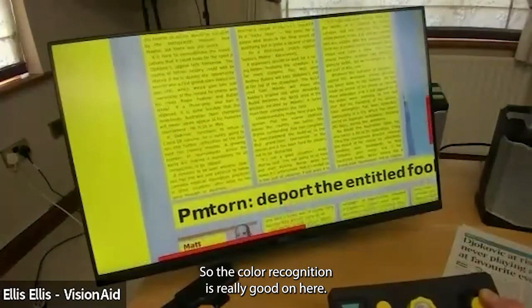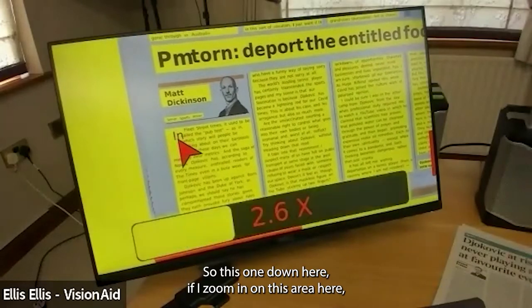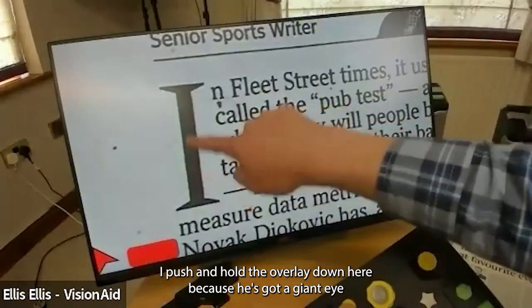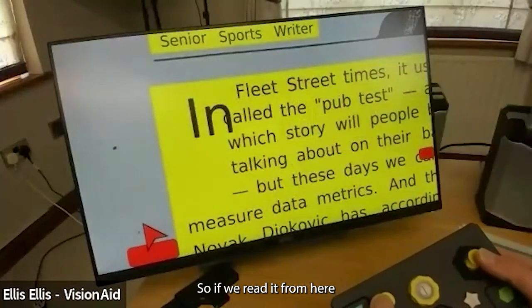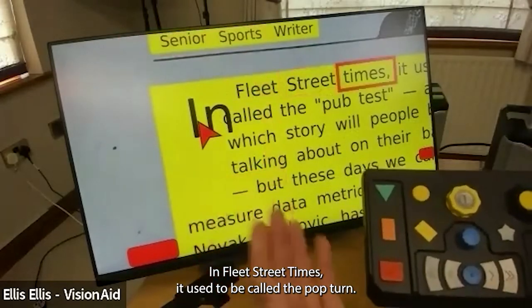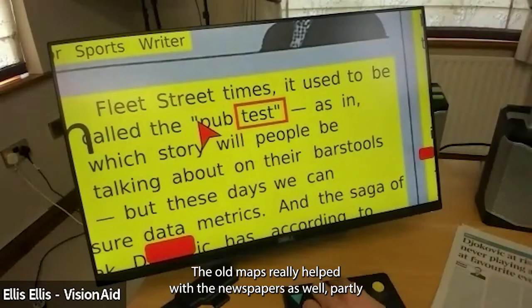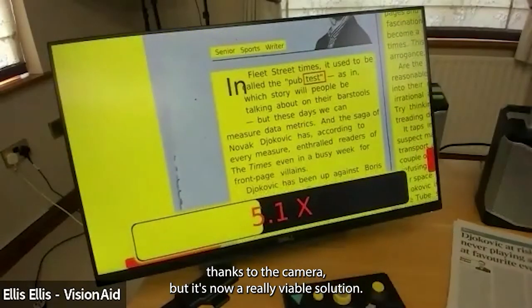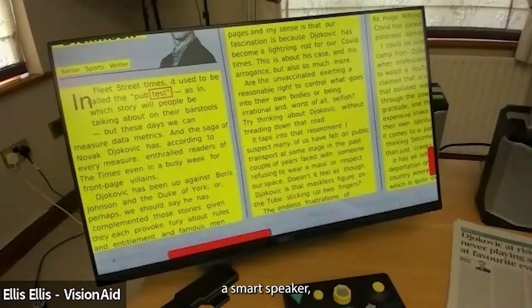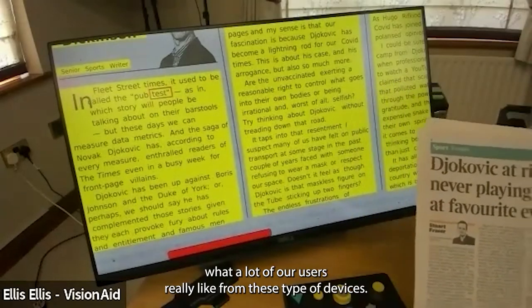Column recognition is really good — it's correctly reading across the columns. Drop caps are also attempted: a giant 'I' followed by 'N' is recognized as 'in Fleet Street — times it used to be called the pop test.' The accuracy gains from the previous Evolve to the Evolve Max really help with newspapers, partly thanks to the camera. It's now a really viable solution for users who don't want their newspaper in digital or audio format and prefer to sit down with a physical newspaper and a cup of tea.